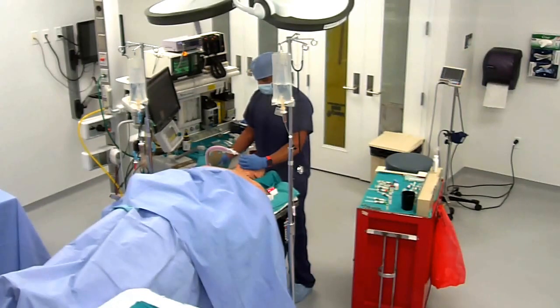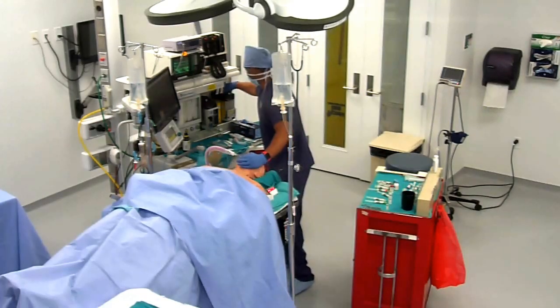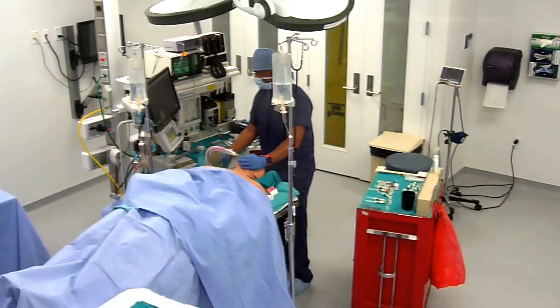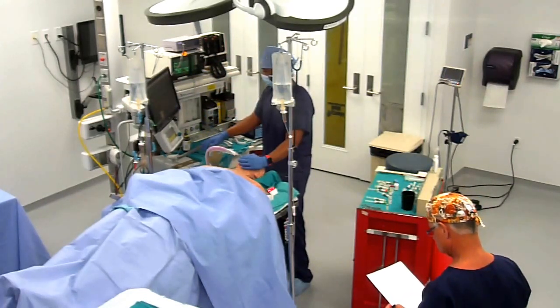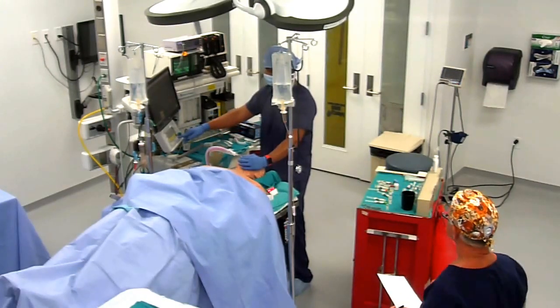And now that I feel like the tube's in place, patient is asleep, my airway's good, I'm going to go ahead and tape the tube, and I'm going to tape the eyes. And I'm going to turn on my sevo to 2, and I'm going to turn my ventilator on. I want to assess to make sure my bellows reaches 600, which is what my tidal volume is set at, and also want to look on the monitor. Okay. And again, my CO2 is 37. Good. 600 on the bellows, 600 on the monitor.